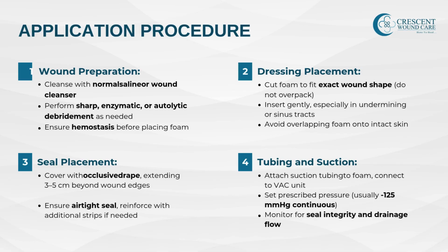6. Start therapy and monitor. Activate the pump, observe for immediate contraction of the foam, and ensure there are no leaks. Always provide patient reassurance during this process, explain what to expect, and assess their comfort level after therapy begins.